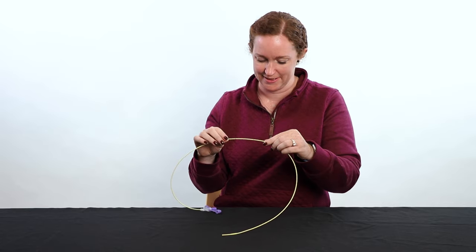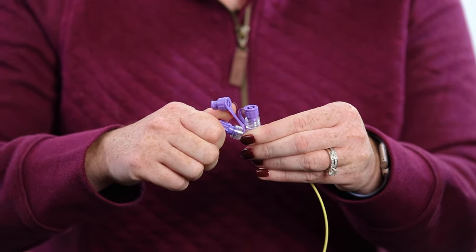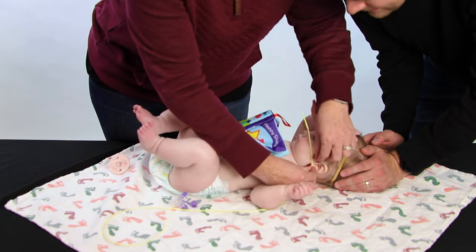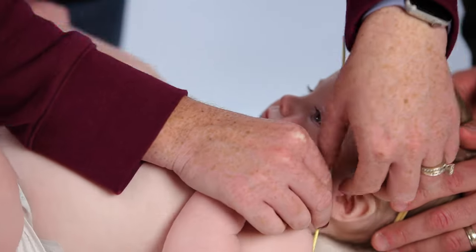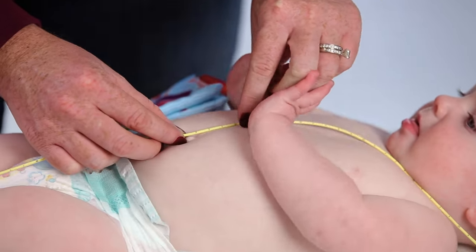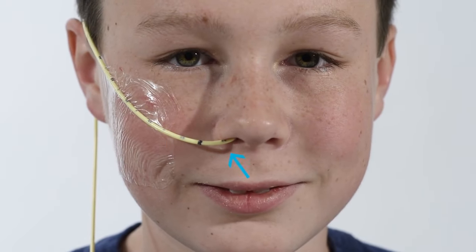Now that you've inspected the tube and have securely placed the wire, it's time to measure the correct length. If necessary, have a partner help hold your child's head straight while you measure. Start measuring by holding the opening of the tube at the child's nose. Go to the earlobe and then to a point midway between the lower tip of the breastbone and the belly button. Mark this area with your permanent marker. This mark should always be visible at the nostrils to show you the tube is in the right place.